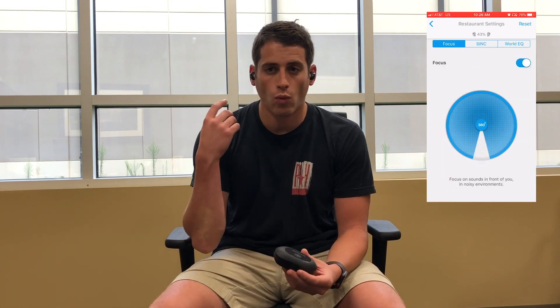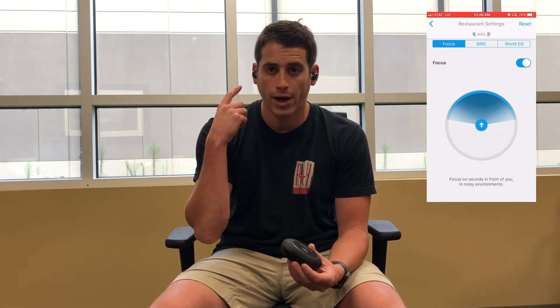It's worth pointing out that with hearables in general, one of the major differences between these and legacy products is that you can upgrade them through software and firmware updates. For example, Nuhara just released a new firmware update for a feature called Focus, which converts what are currently omnidirectional microphones in the IQbuds into directional microphones, giving you more control around the way you use these devices in an amplification-type setting.